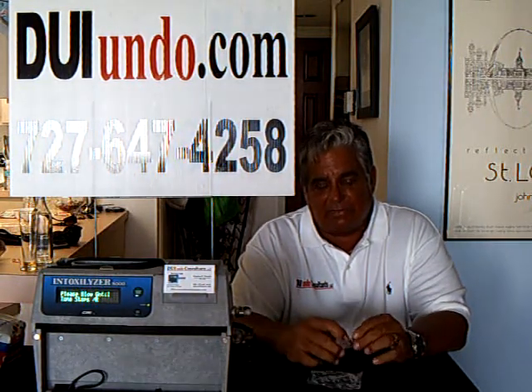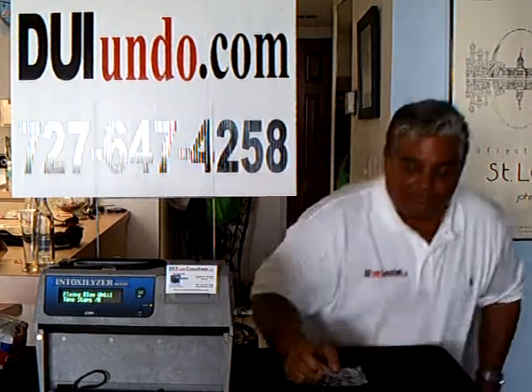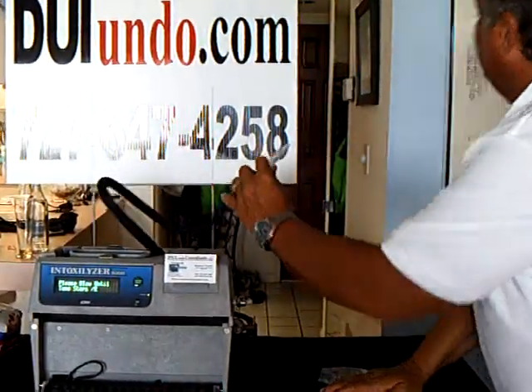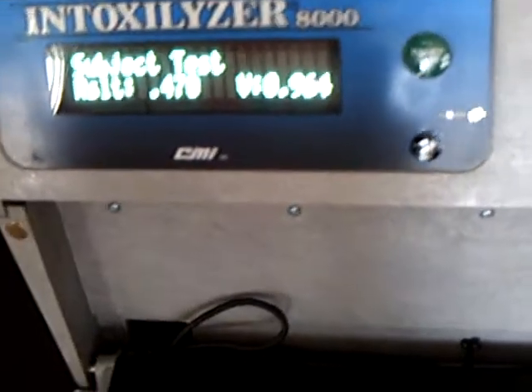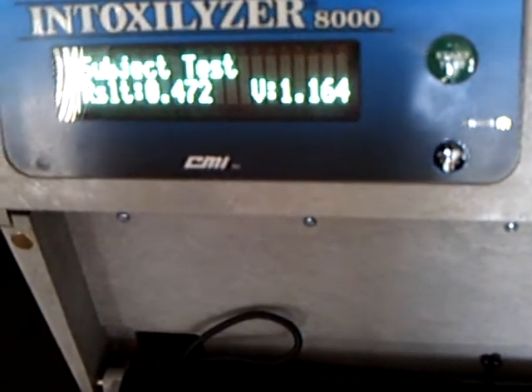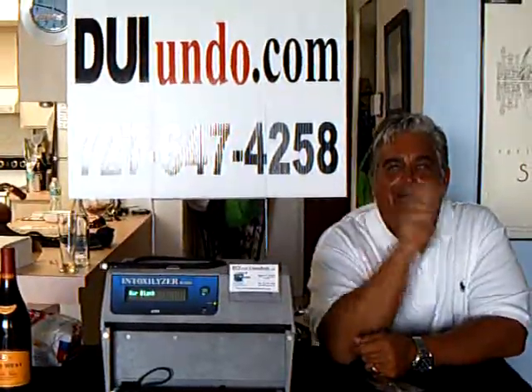Hopefully I can get you a high reading. My personal best is a .547, so let's see what we get this time. Alright, there you go. I just blew a .472 — .472 with a 1.16 breath volume, folks. Again, that was pure mouth alcohol.